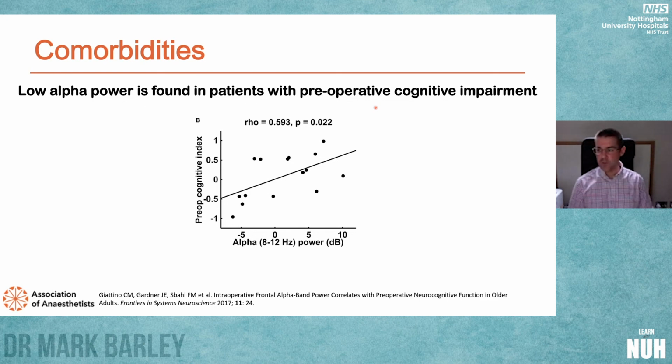Our anaesthetics have a wonderful effect of hugely increasing the amplitude of the brain waves in the frontal cortex, allowing easier deduction of the underlying rhythm. And there were neurologists in the States using doses of thiopental in patients with Alzheimer's to accentuate these waveforms to try to make an Alzheimer's diagnosis.